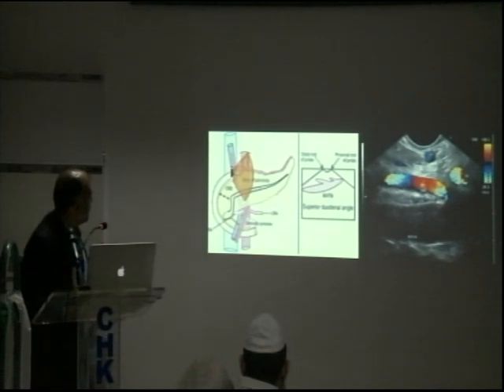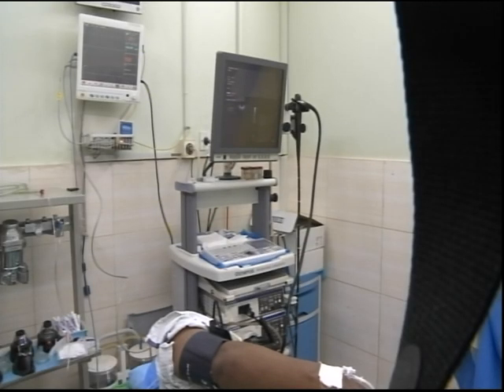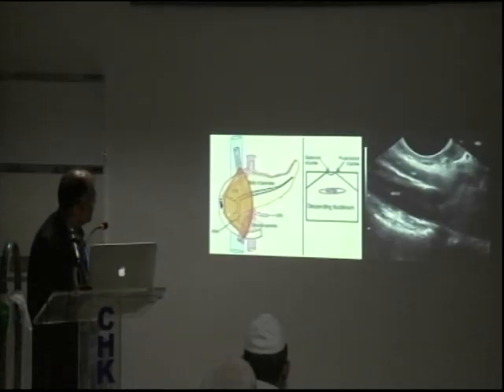All right. Okay, so again, you have this aorta here, you have SMA coming up here, and you have this splenic artery here, and you can have the vein, left renal vein, between the superior mesenteric and all these things. Okay, this is SMA again, and this is the aorta, and this is where we are at that moment.